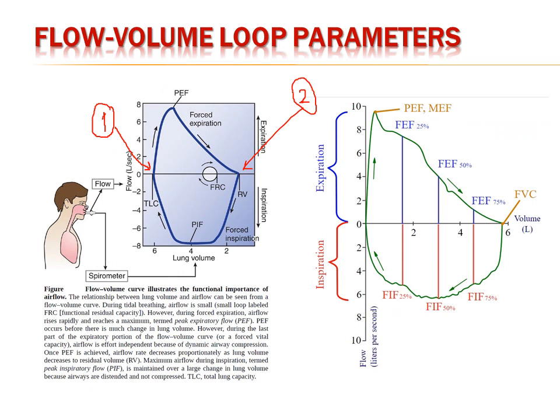Now, how do we perform the test, and how do we obtain the flow volume loop? The test starts at point 1, as you can see in the graph. We ask the patient to take as much air as he can to fill his lung, meaning we are going to reach the total lung capacity. Once his lung is fully filled, we will start the test, and we will ask the patient to exhale the whole amount of air he can expel, and as fast as possible.